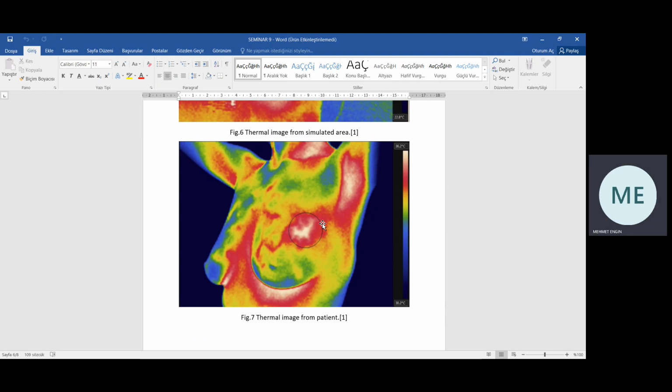On the other hand, control temperature varies in a specific range, namely the operation range, because of the mathematical structure of control and tuning parameters. These variations could be eliminated by adding an external cooling system to maintain the set temperature on the surface reflected by the actuator.